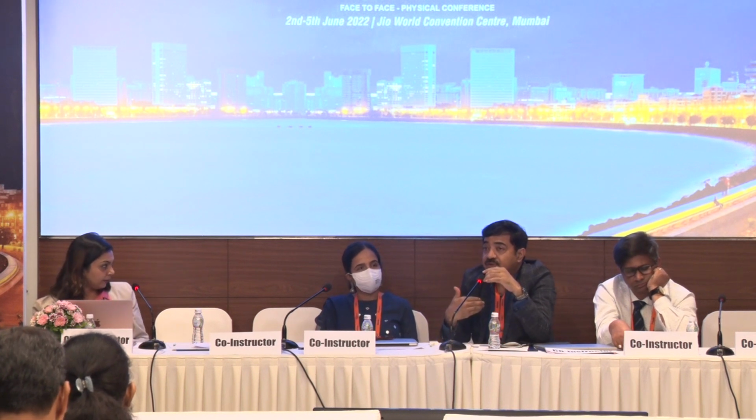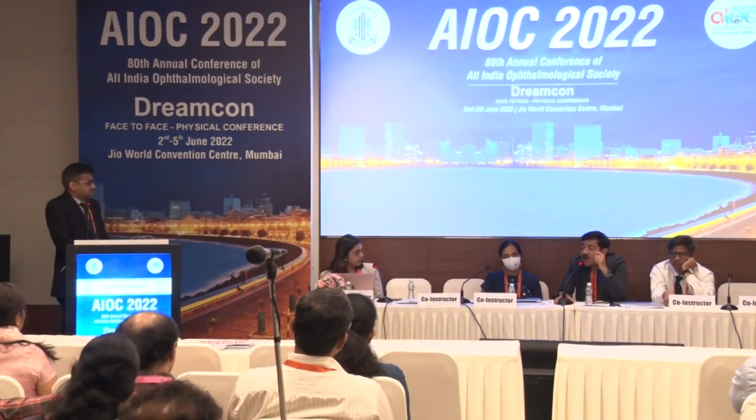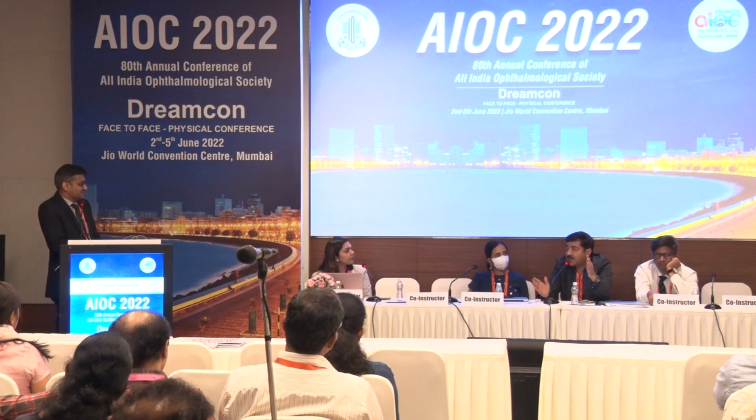Do I have any further questions here? Yeah, I have a question. We got initiated into Toric lenses maybe 12 or 15 years back. We didn't have all these things. All our measurements were by the autoref and then the manual. A lot of patients with 2, 2.5, 3 cylinder, we jumped into it. We said this is the ideal patient, I'll reduce your astigmatism. And then we ended up with patients saying, sir, we are again wearing glasses, still 1.5. Now, we didn't know all those things.